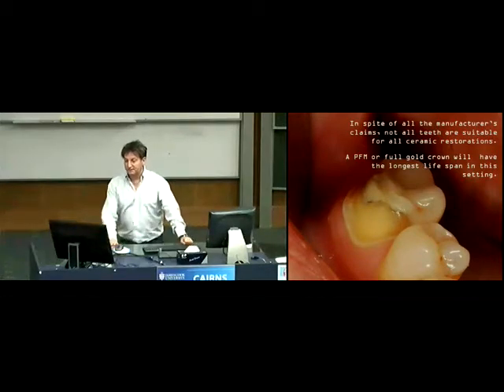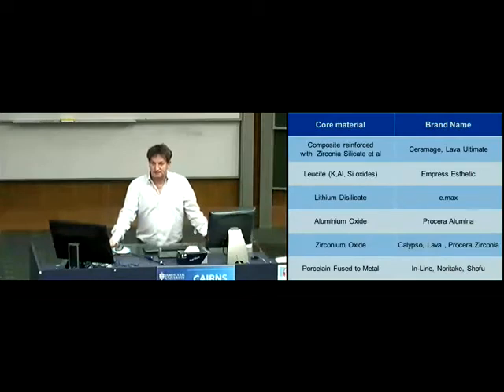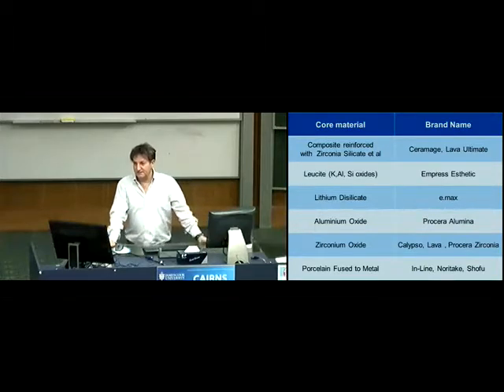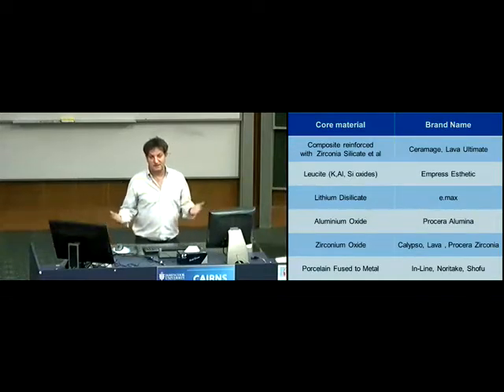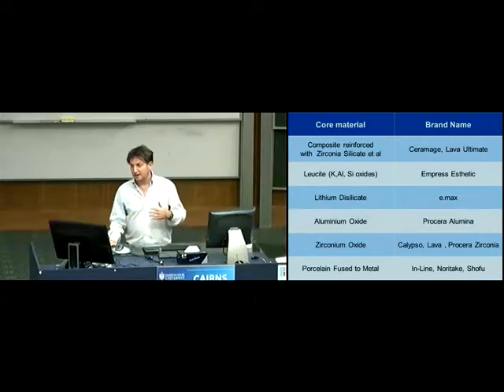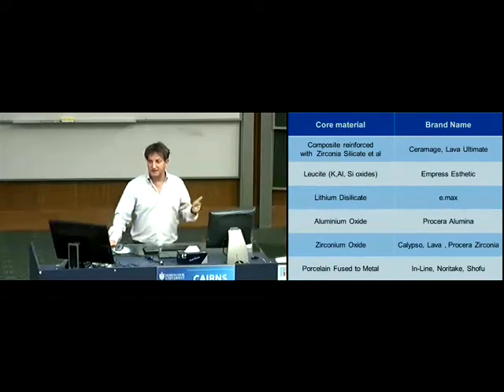Okay, so look, here we go across and we look at all the materials that are currently available. There's some stuff on here which is brand new. You see up the top right-hand corner a product called Lava Ultimate. Again, 3M are out there trying to convince everybody, and they've called it a nano-filled ceramic resin. They use all these great words, but at the end of the day, it's a reinforced composite. Don't let anybody fool you. I'm going to talk a lot about 3M and the evolution of materials with 3M. They're heading in the right direction, but that's something we need to talk about.